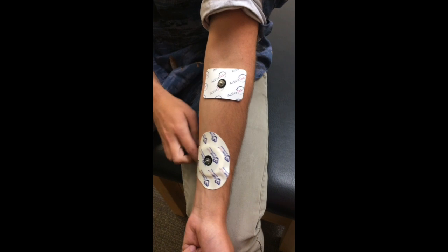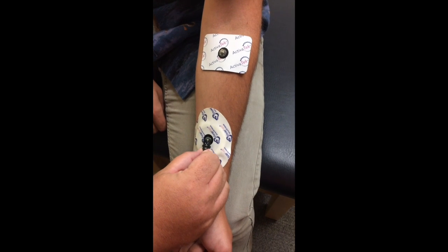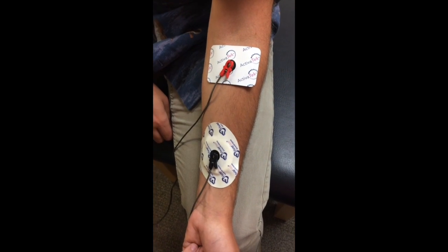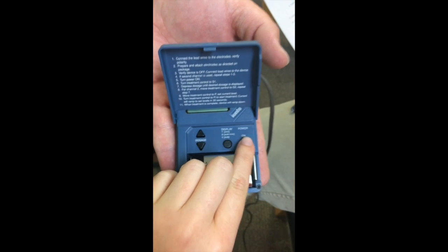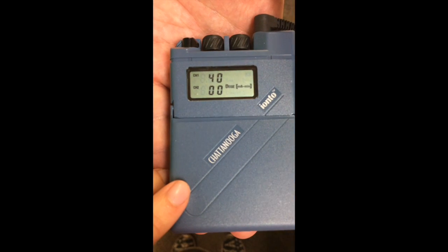Now that we have our pads placed, because we're using saline, which has a negative polarity, we're going to hook up the negative to the medication pad and then the positive to the other one. First, you want to turn the unit on. Since we're using saline, we want to make sure that the dosage is 40. So we'll turn the dial to 4.